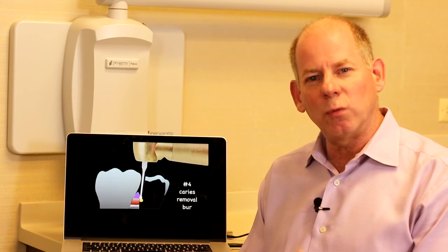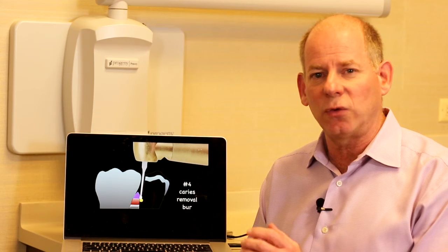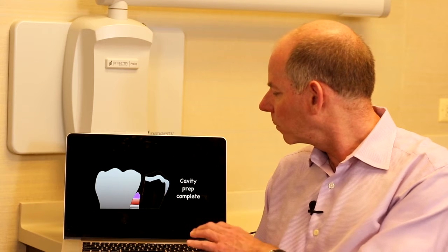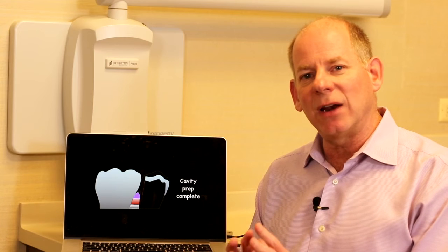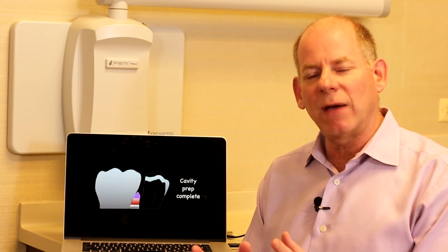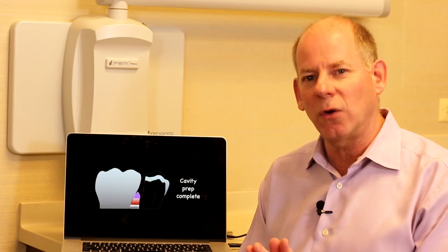I'll typically need to go in with a caries removal bur — a number 4 or number 6 — and sometimes a surgical-length caries removal bur because the caries are so far down that proximal root surface. I want to get all the caries out. I may need to stop and take a radiograph to be certain all the caries are removed and my burs have extended all the way down. This is very difficult to do in the mouth, no doubt. But a conservative restoration rather than prepping for an onlay or crown is a much better way to go — we just have to make sure we get the caries removed.